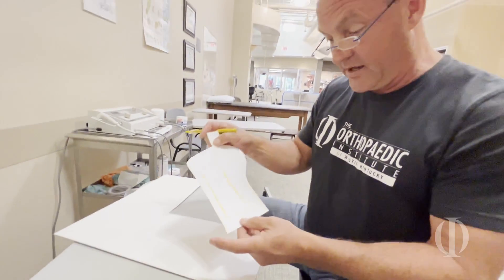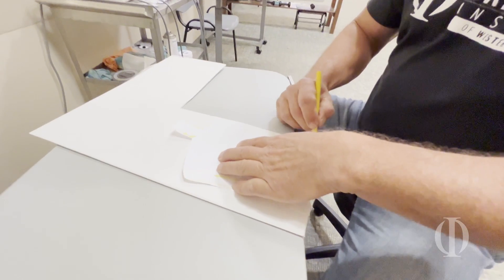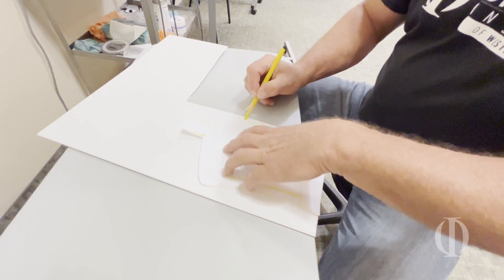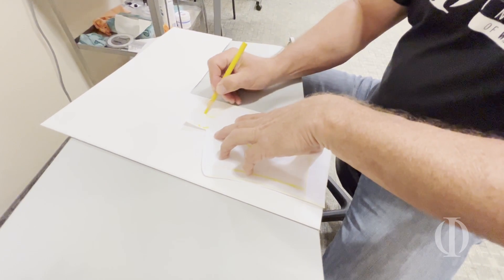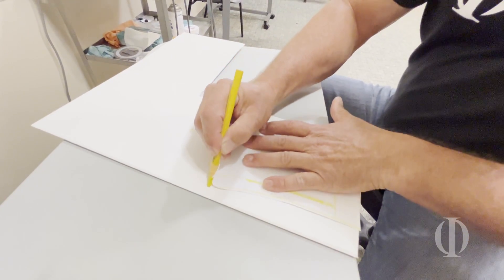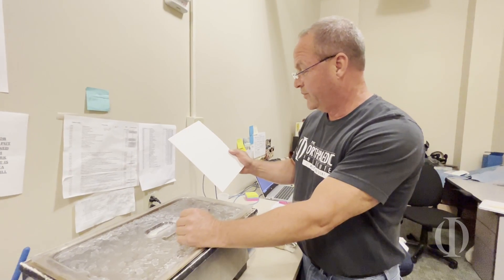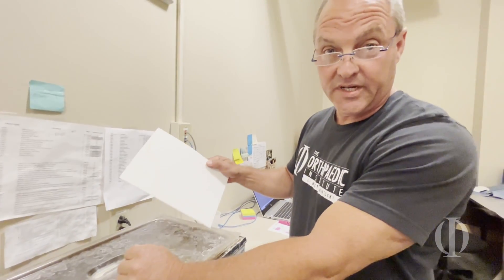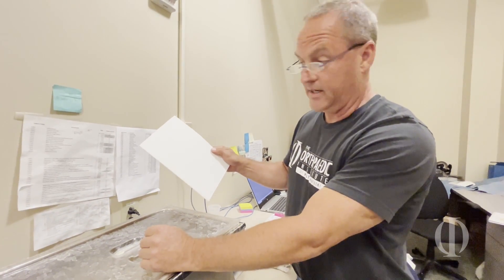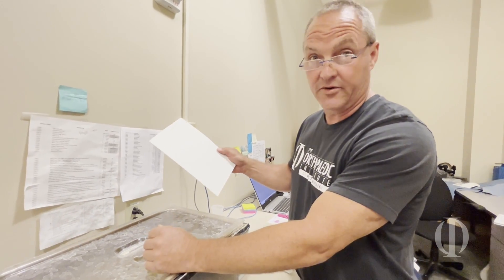I have my template cut out that I had traced around my hand. I'm going to put it on a piece of plastic and trace around my template so I can cut it out of the plastic. Now that I have the pattern transposed onto the plastic, I'm going to put it into this hydrocoilator and it will heat the plastic up so I'll be able to easily cut it and then later form it to her hand.